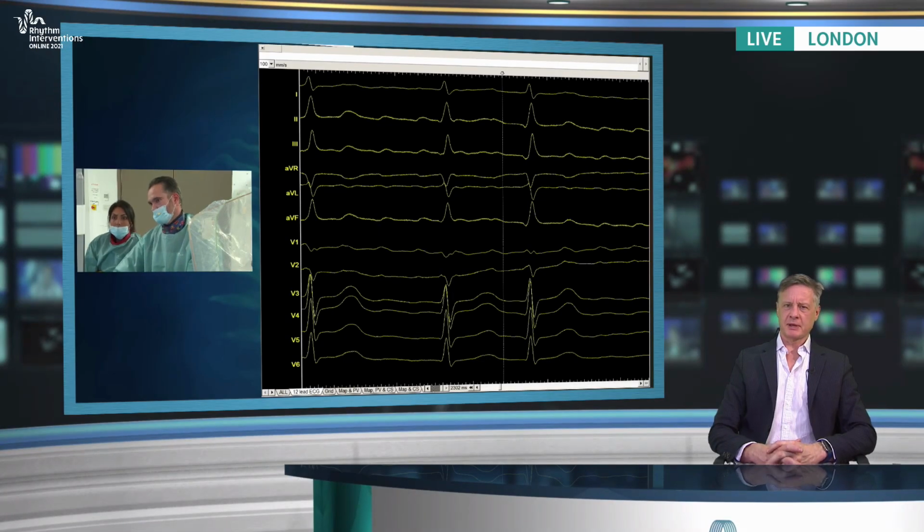Yeah, great. Okay. And while you're doing that, I would like to propose to the panel that one of the reasons that we may see more organization is because the encirclements produced by radiofrequency are larger than they are with one-shot techniques. Am I being excessively controversial here? Maybe ask Jan first. No, I think that's perfect. In my eyes, perfectly reasonable way of thinking about this. I fully agree.